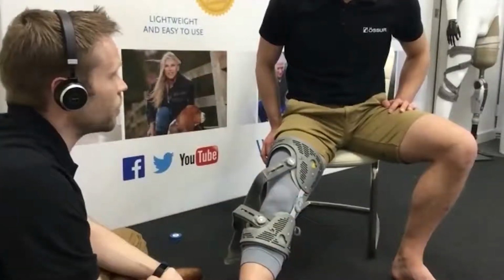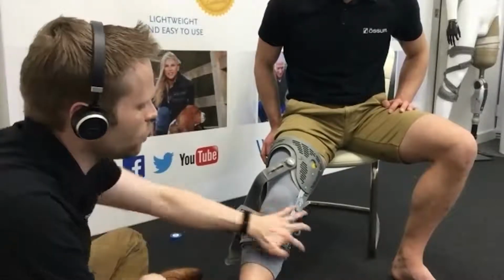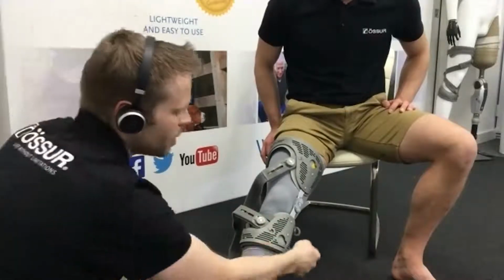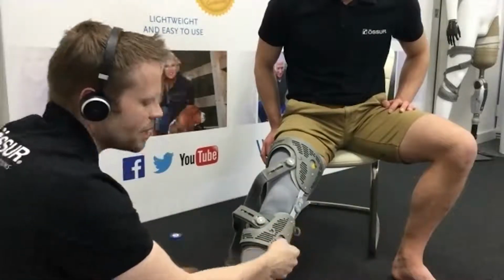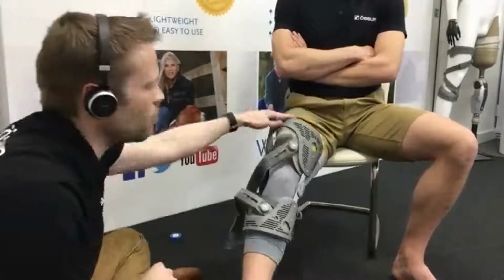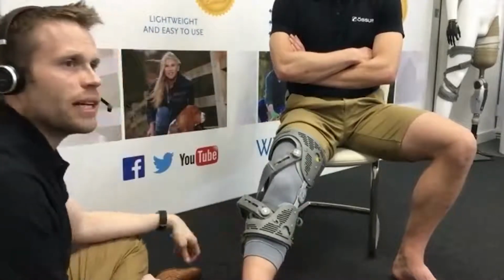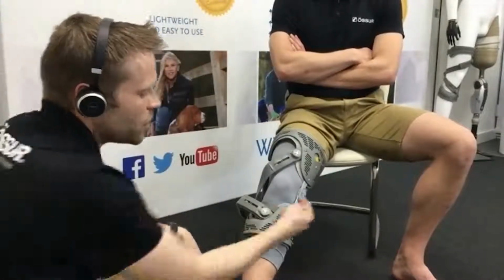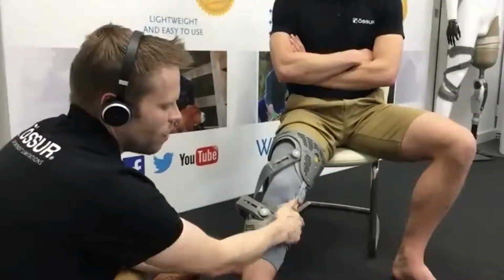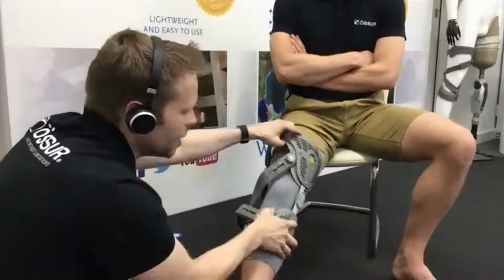Okay, so it's important to think about a few other sort of different issues that we might come up with. So very occasionally you can end up with sort of redness in this area. That's a common area that we can end up with an area of redness there. So what's really important is that we're checking the hinge position. So what is very common when we've got an area of redness here is actually that the brace has been fitted a little bit too low.